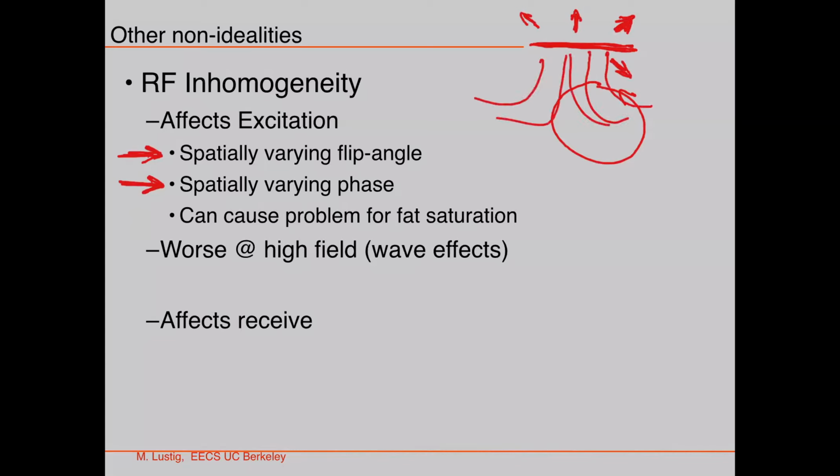So that also means that if I apply a non-uniform RF excitation, it also has a phase component associated with it. That's actually one of the sources of phase in an image. I told you that the image should be real, but it isn't. One of the sources of phase is this space varying RF excitation. That's why the image is not real. Well, it's a real image, but it's not real valued.